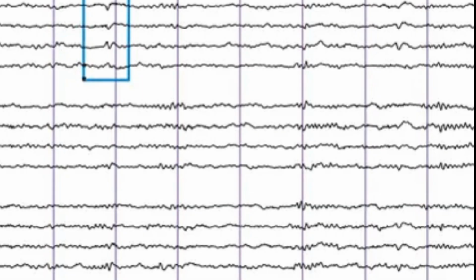Why do they call them epileptiform if they're benign? Because they can kind of look like seizures on the EEG, but they're not seizures. So these BETS, these small sharp spikes, where do we usually see those? You see them primarily during drowsiness and light sleep, and they're especially prominent in the temporal regions of the brain, kind of above your ears. So they're totally harmless.